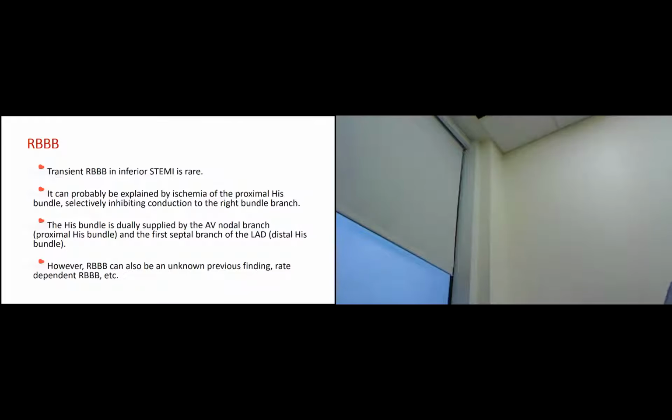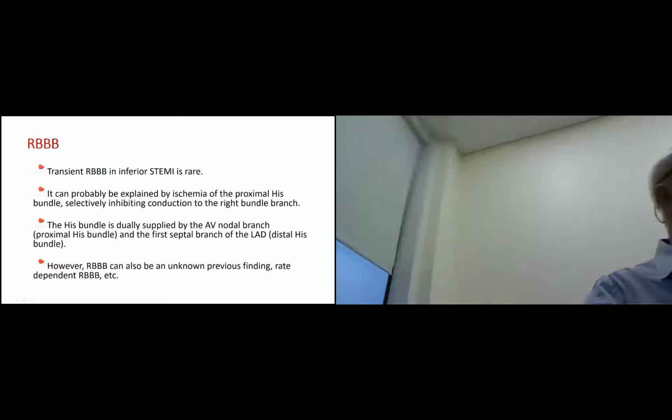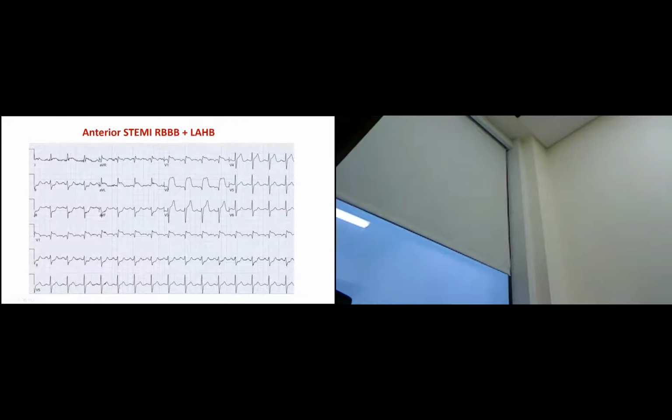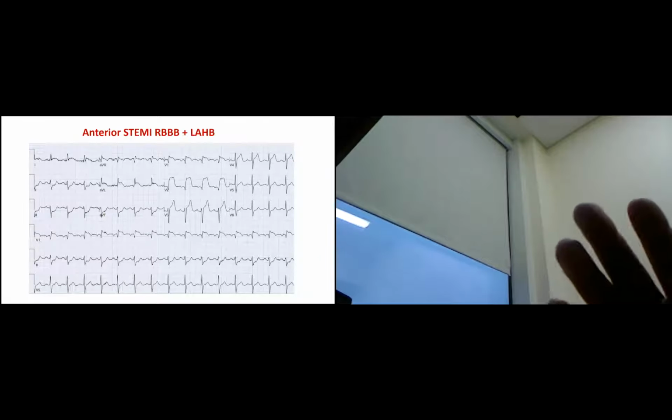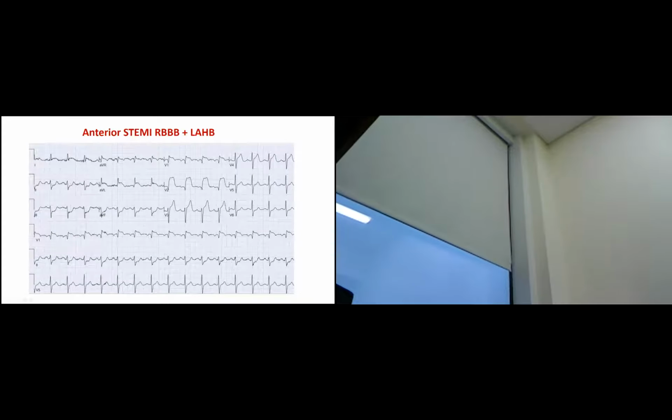This is a typical case of proximal LAD occlusion. This is a dreadful sign.